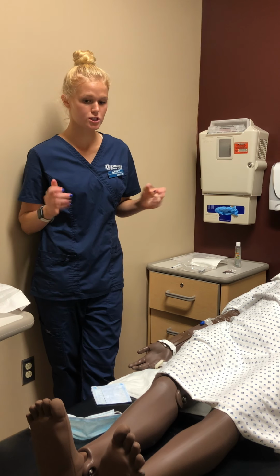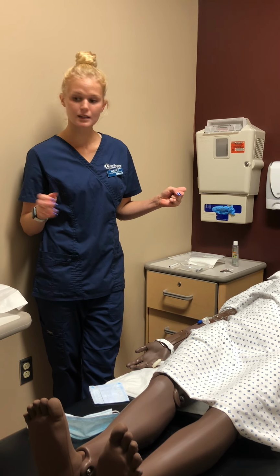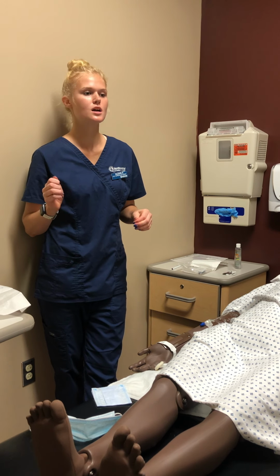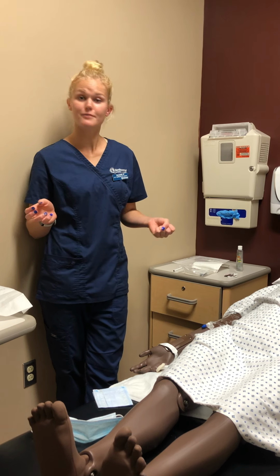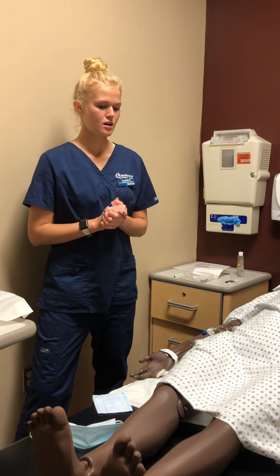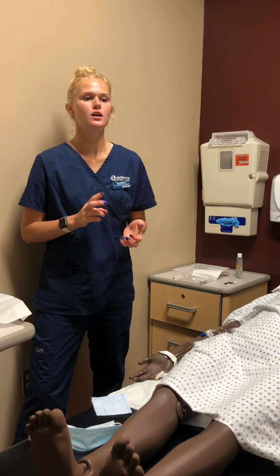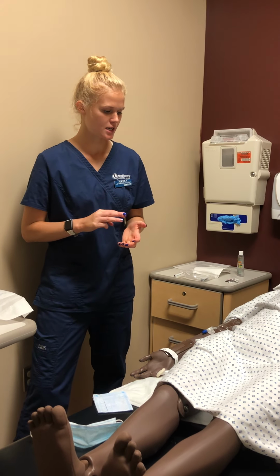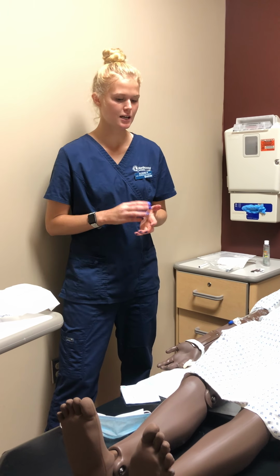I'd want to dispose of all my supplies. I'd want to gather my supplies in the first place. And then I would want to document my findings. So what I would document today would be all my different assessments, any infiltration, any dislodgement, any extravasation.